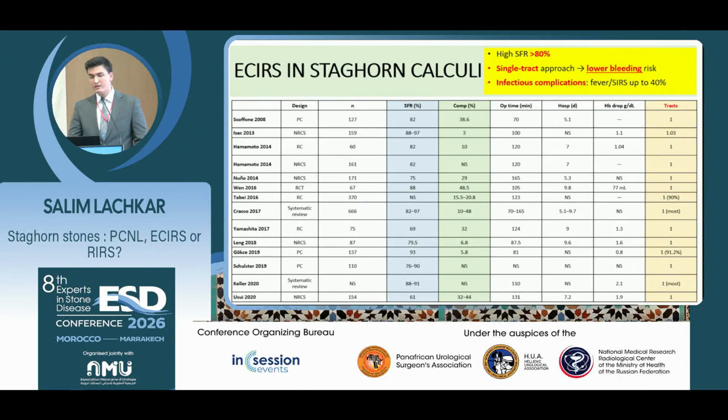About ECIRS in staghorn calculi, there is also very important literature. We have a high stone-free rate. It's a single tract approach, so we lower the bleeding, which is the main concern in percutaneous technique, but we have to mention that there are more infectious complications.